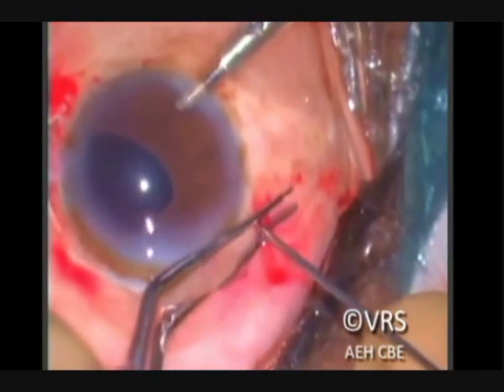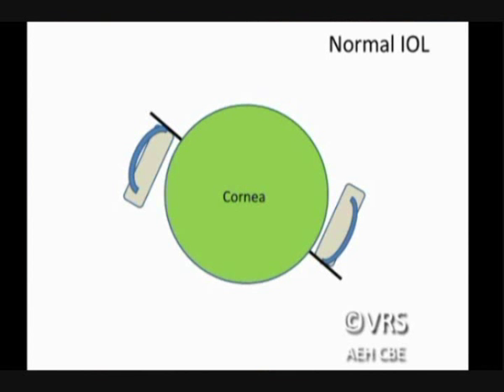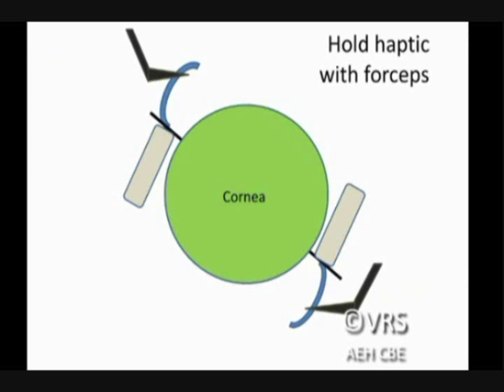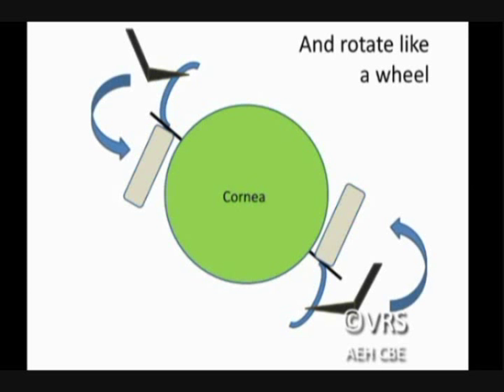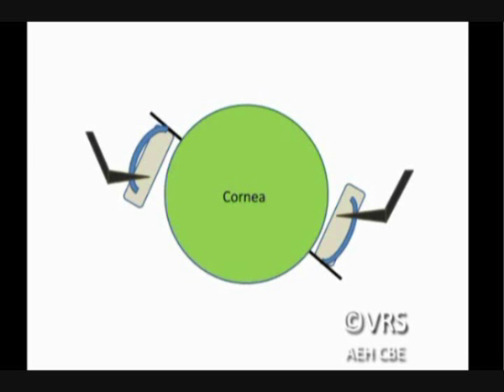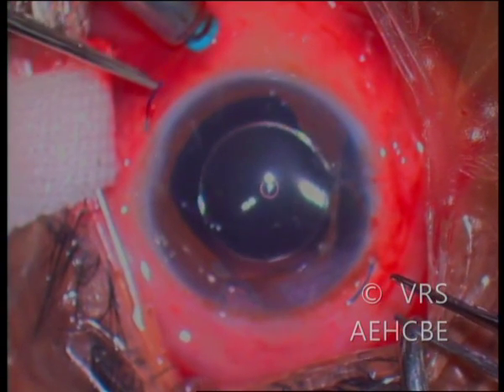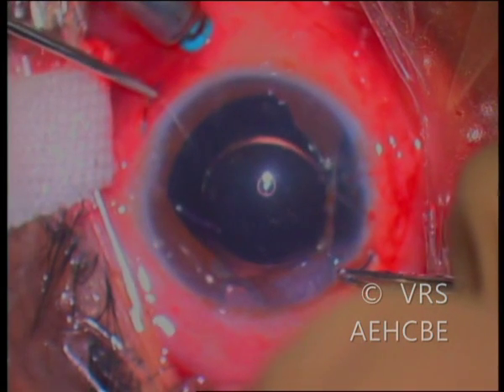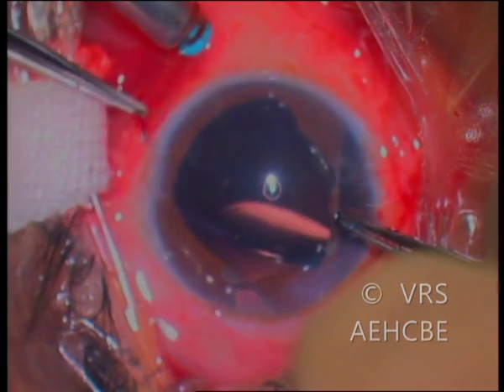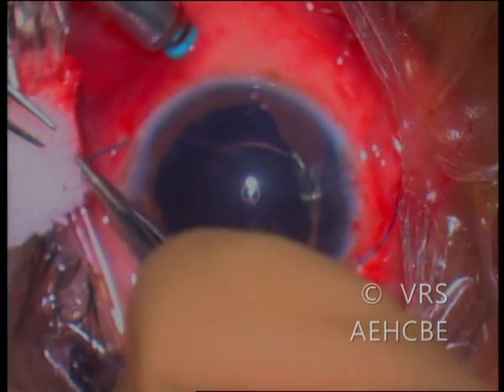Sometimes when injecting a foldable IOL, the lens can get flipped — that is, the upper side can go down — so the haptics will be facing in the opposite direction. What you have to do is hold both the haptics using two McPherson forceps and rotate it like a bicycle pedal simultaneously. This will flip the IOL to the right orientation. The IOL is flipped over so that the haptics face the right direction, and these haptics can then be held with the McPherson forceps and internalized, that is, inserted into the scleral tunnel which was constructed earlier.